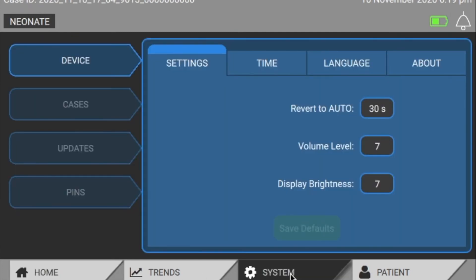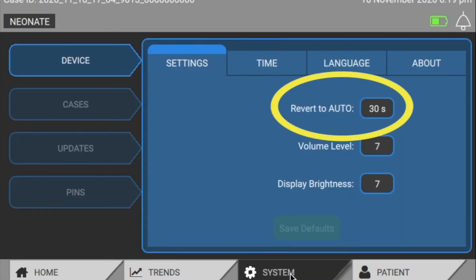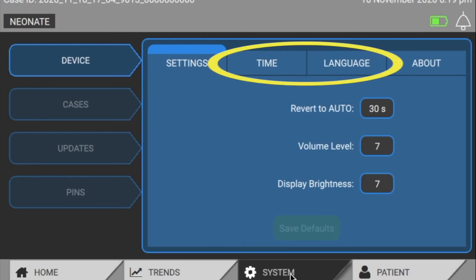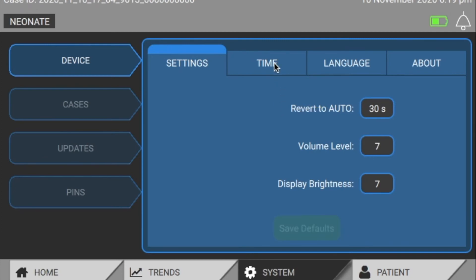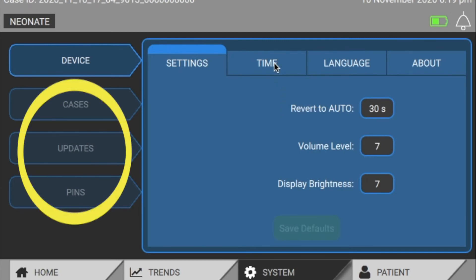On the system screen, you can change the revert-to-auto time as well as other system settings such as time, language, volume, or display brightness. You can also use this screen to update software, download case data, or change your pin codes.